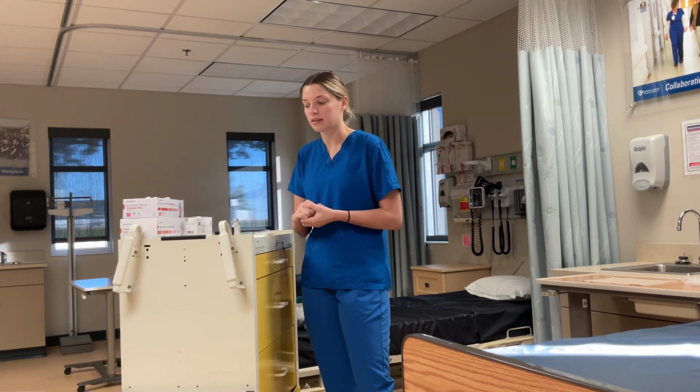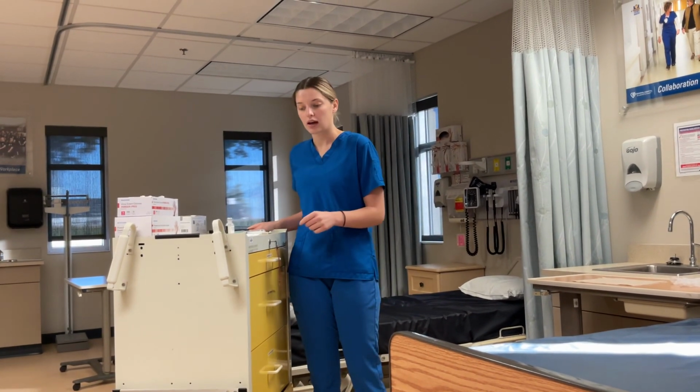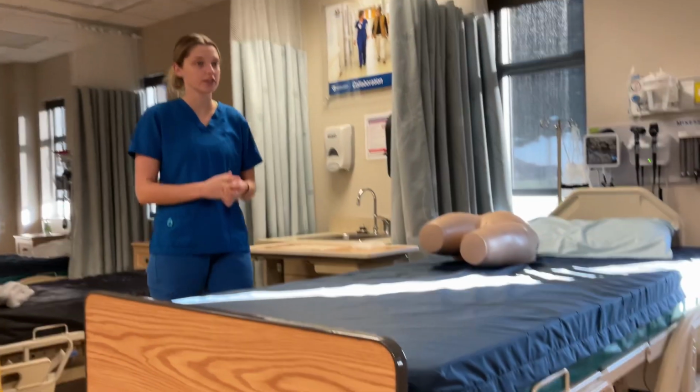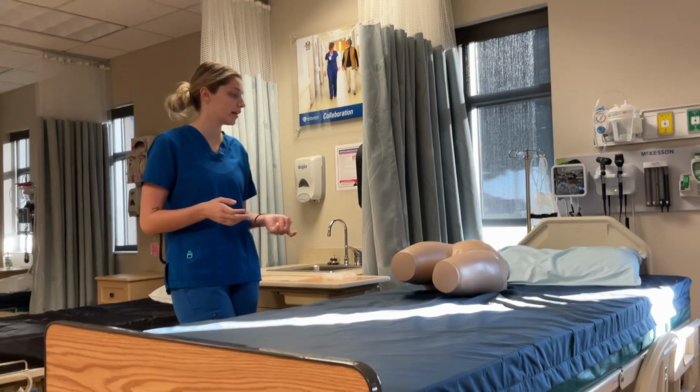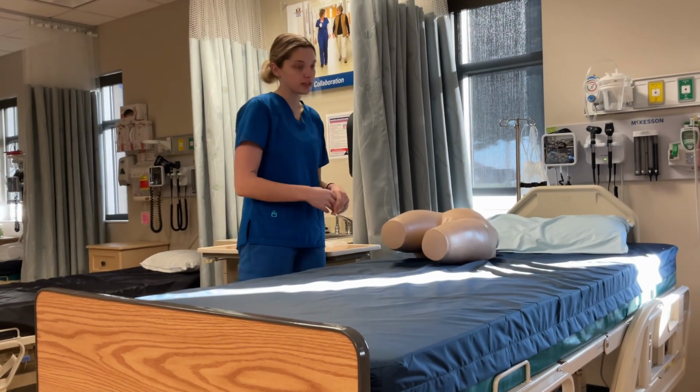And then now I will do my third med check. So I will enter the client's room, knock knock. Hi, my name is Jenna, I'm your nursing student. Can you please verify your name and date of birth? I would look at their wristband to make sure it's the same.